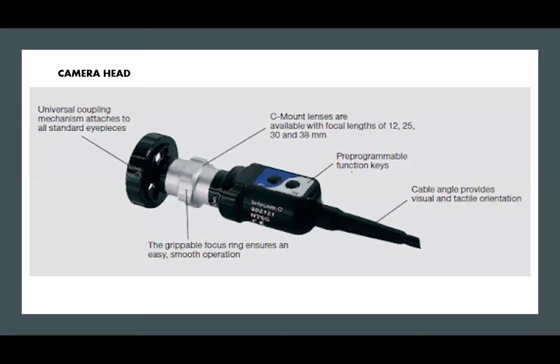Now, this is what the camera head looks like. It has a universal coupling mechanism, okay, that attaches to a standard eyepiece of the laparoscope or the telescope.